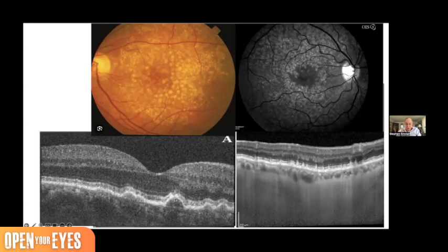So here are deposits on top of the drusen, on top of or within the pigment epithelium, as well as abnormalities and swelling of the pigment epithelium itself, not paid attention to before. And can you see the rod and cone layer there? Can you point that out?